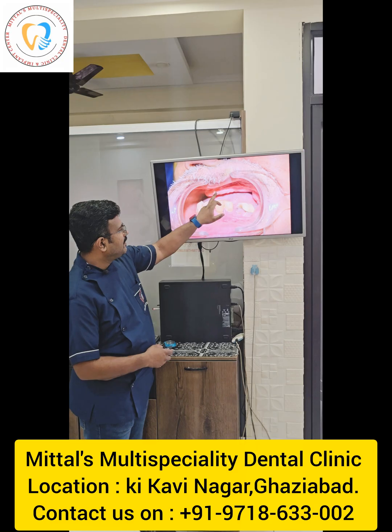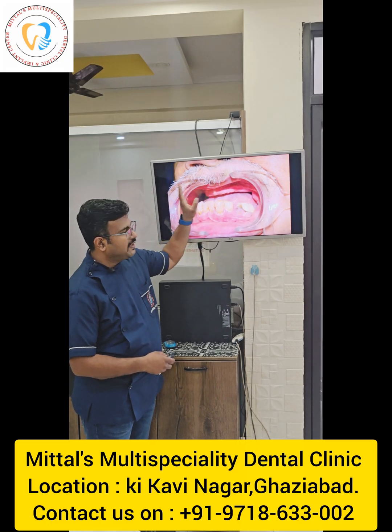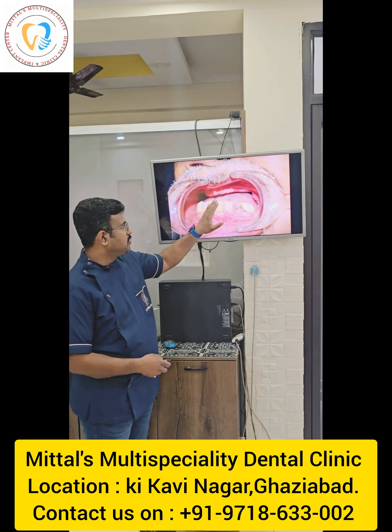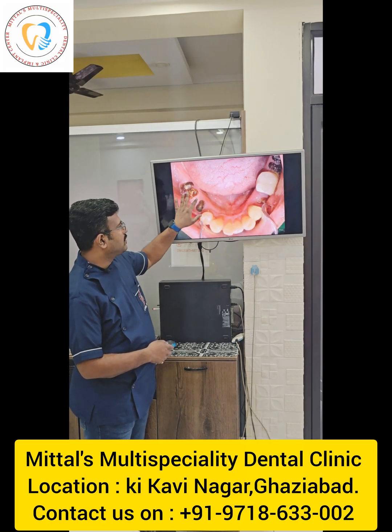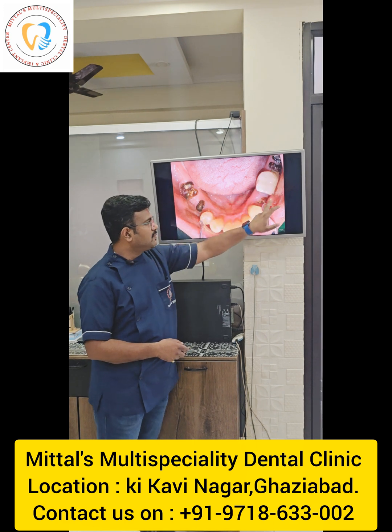You can see the maxillomandibular relation also. This maxilla is too much inferior, or internal, to the mandibular anteriors. This is the maxillary arch, this is the mandibular root stumps. This has to be removed because there is a furcation involvement in the roots.